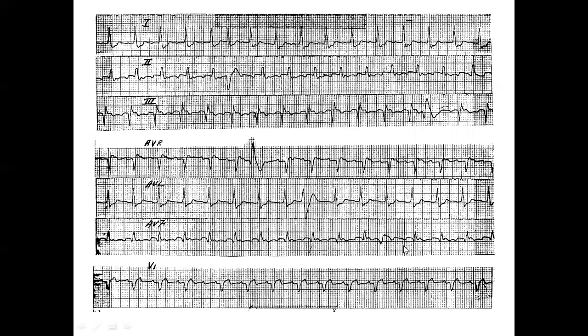So how many of you are comfortable in calling, oh, that's a typical flutter wave, rather than one inverted P next to inverted P? No. Slanting up, sloping up, slanting down, dipping, sloping up, slanting down. Well, unfortunately, the QRS is interrupting it. But only one beat is plenty for me to say that, oh, this is atrial flutter. And the distance, okay, here's another one. Sloping up, slanting down, dipping. There may be another one. Well, two at least here and here.